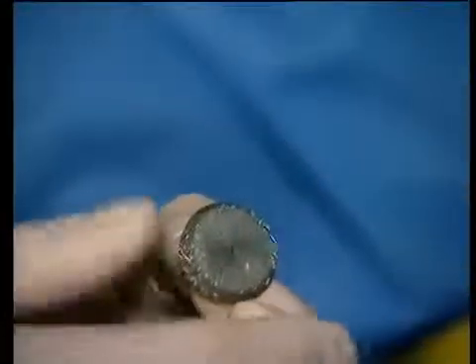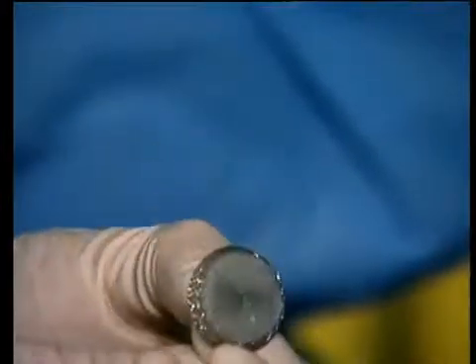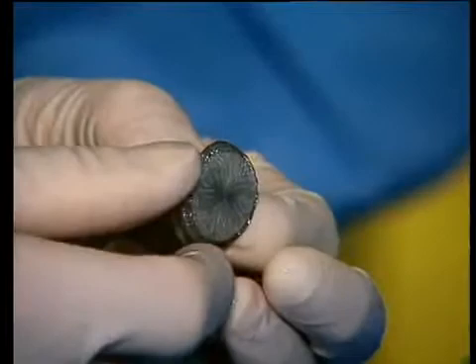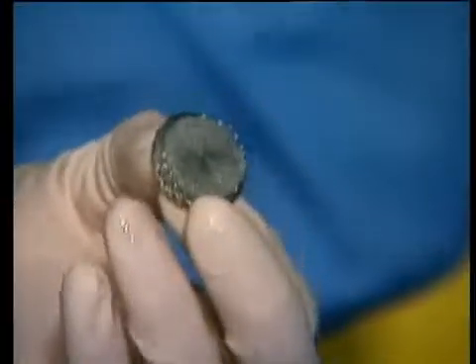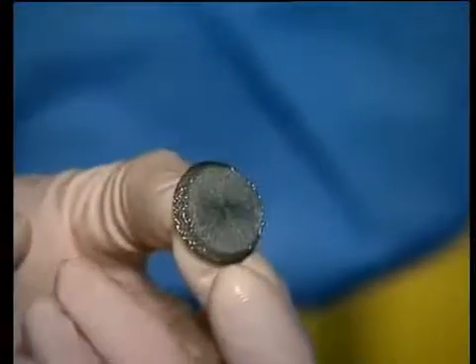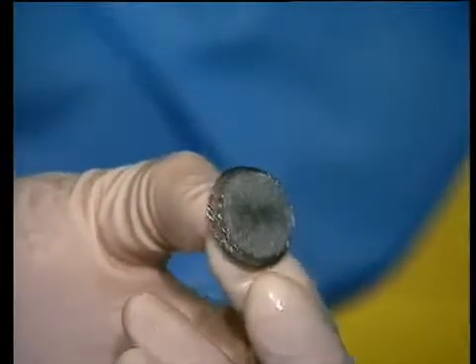We avoid every metal part which is not important in the Amplatzer device. The goal was to make a good device even better, and to incorporate all the good things from the Amplatzer — the flexibility, the retrievability, and the braid — but to avoid the protrusion into the left atrium with just a flat disc on the left atrial side.